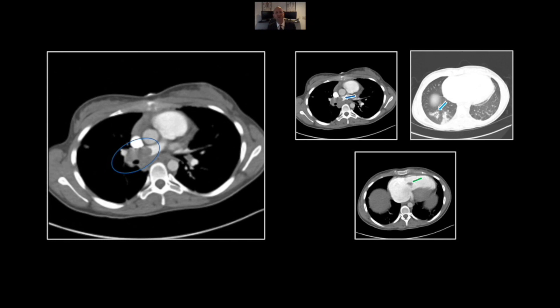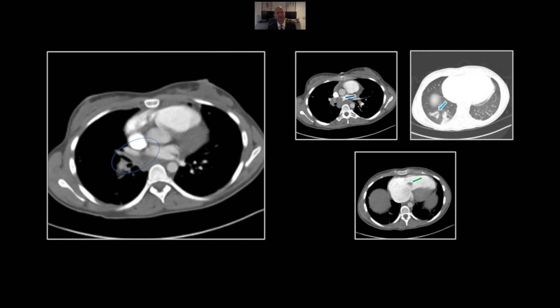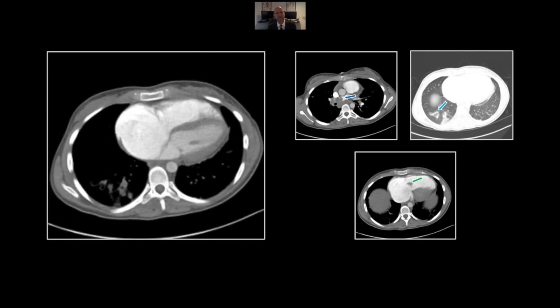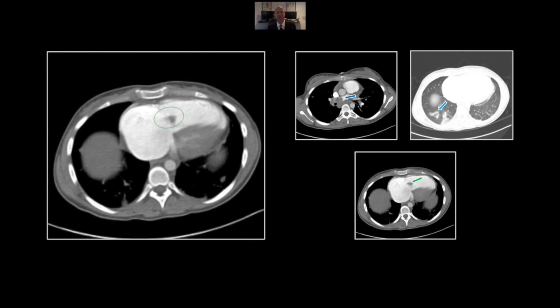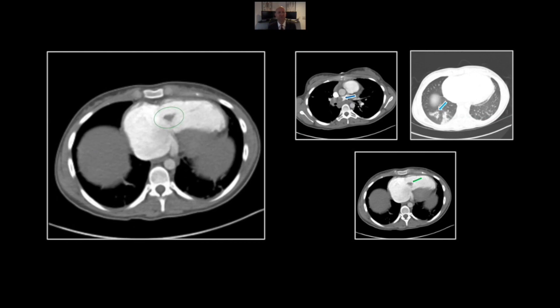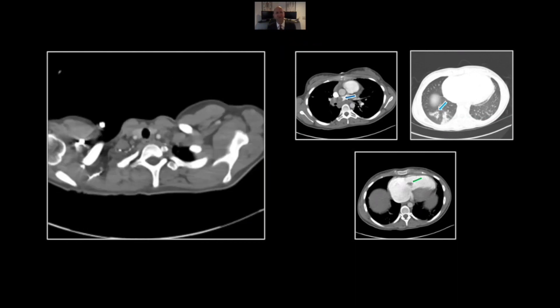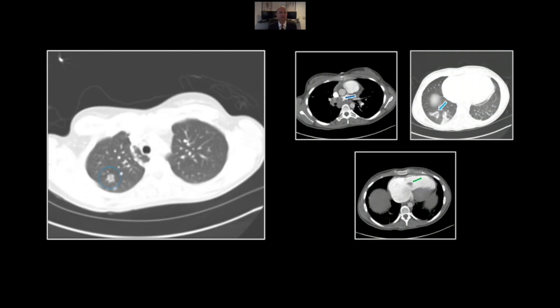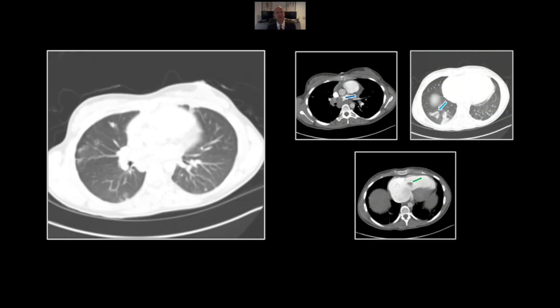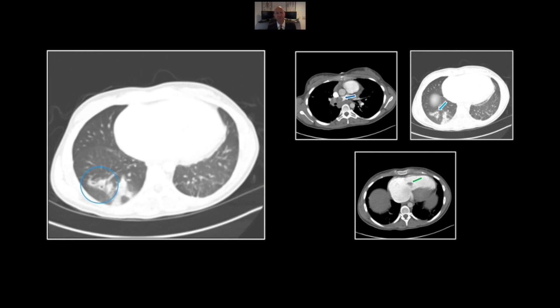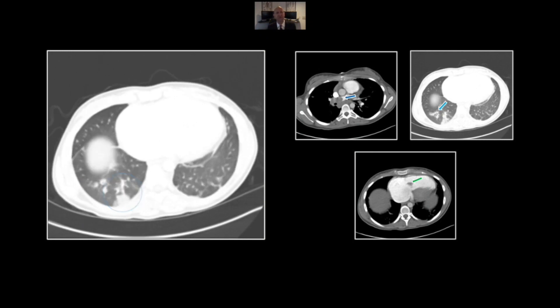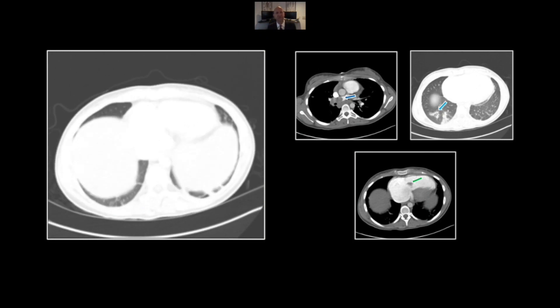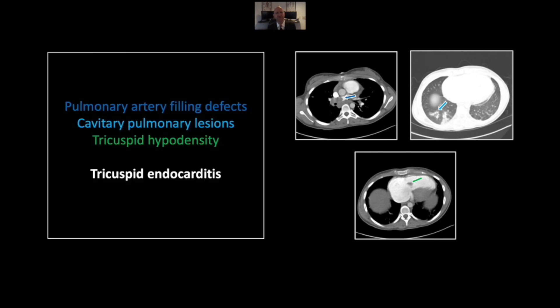Here is that right pulmonary artery filling defect, and here the vegetation on the tricuspid valve. Note again the right atrial enlargement and hepatic venous backflow. On lung windows there are numerous small cavitary lesions, most of them peripherally distributed, and wedge-shaped densities consistent with infarcts. So that is a case of tricuspid endocarditis.